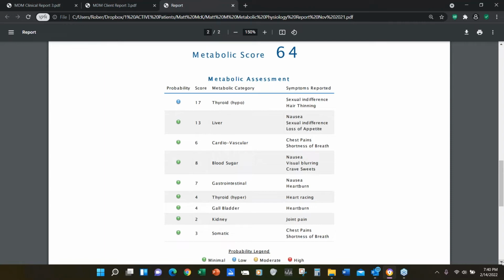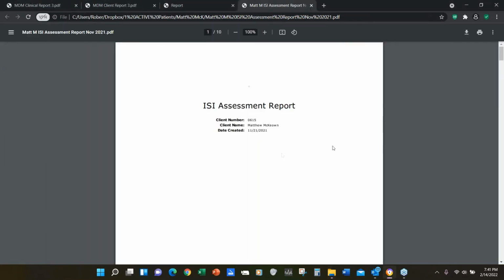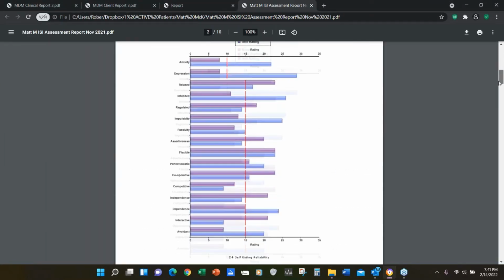All right. Thank you. That's so great. Thanks for your input, Carl. This is the main thing I use before I go into map interpretation. I will use the ISI, but when I think about the relevancy, the ISI is great for the conversation where I point out the difference between their score and the norm or the peak performer.